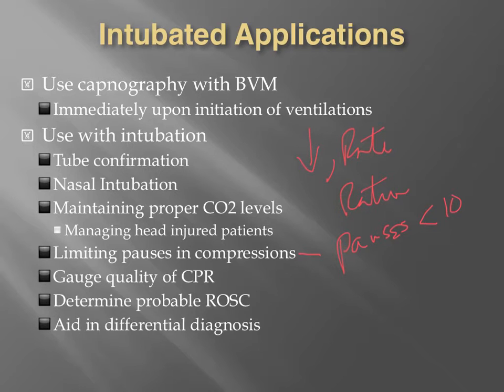So, gauging the quality of CPR. We just briefly touched upon that, but if we're doing really good CPR under normal circumstances, we can get a relatively adequate CO2 level. And theoretically, if we are providing adequate CPR and providing adequate controlled ventilations with tidal volume and rate, then we can gauge the quality of our CPR by our end tidal reading.